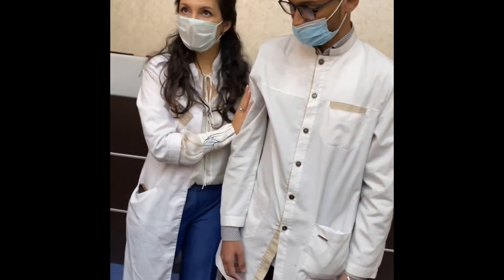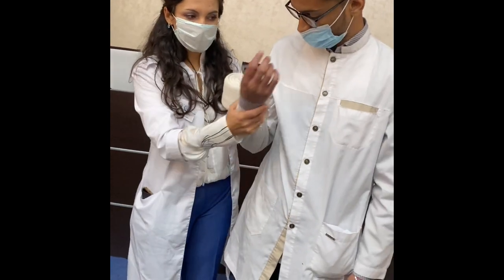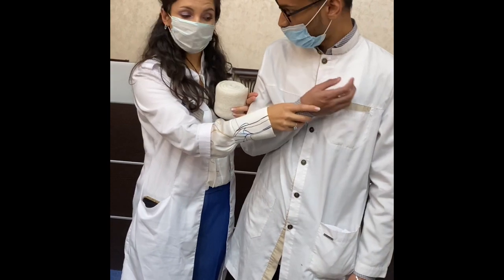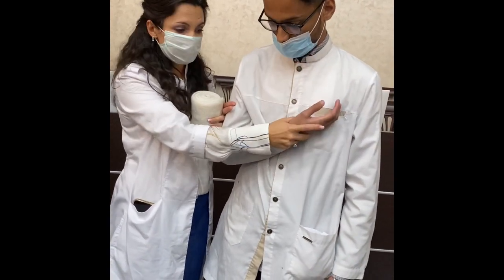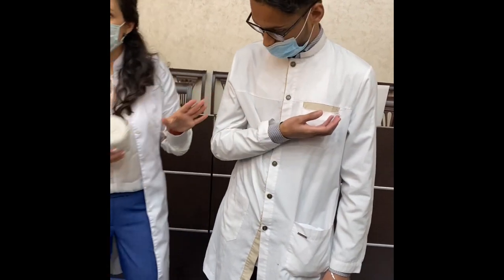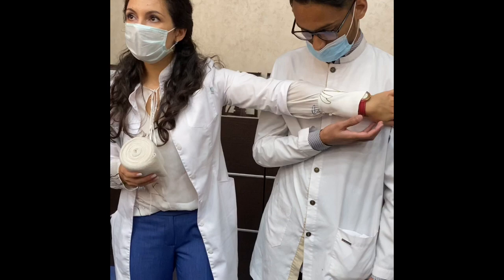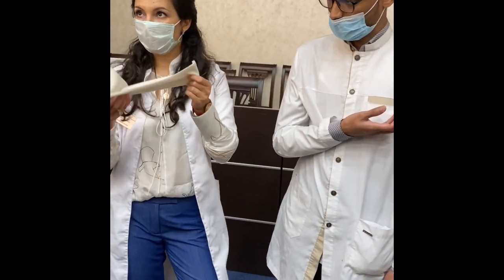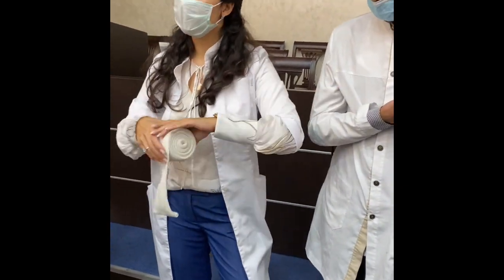We can use only the location. We have to ask the patient what we are doing. The position is supination like this. This dressing we have to start from the healthy side — usually we hold the head of the bandage in the right hand.